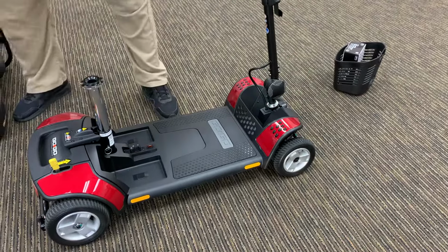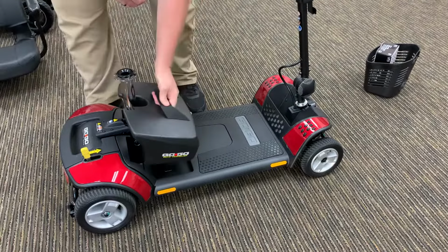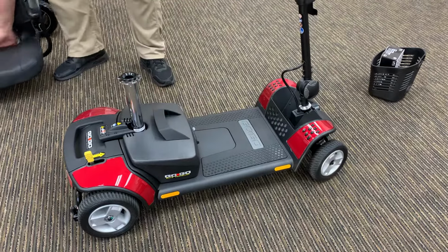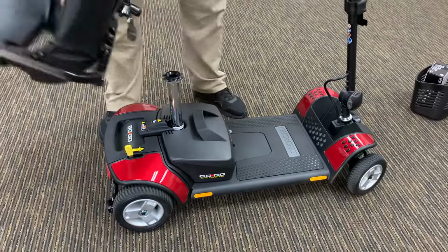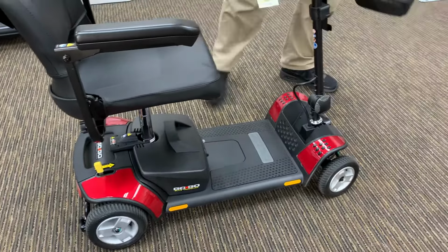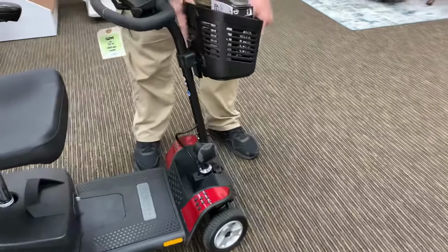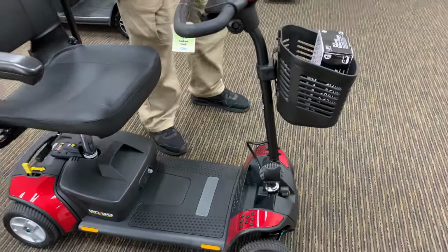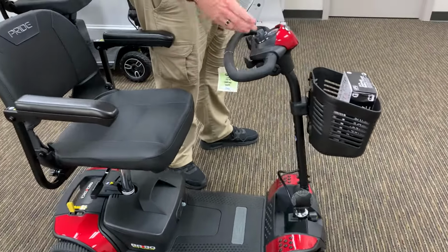Put the battery back on. And then the seat back on. Basket has two places it connects. So make sure you're over those two places. And then if you turn it back on, it'll light up, which means you got it correctly.